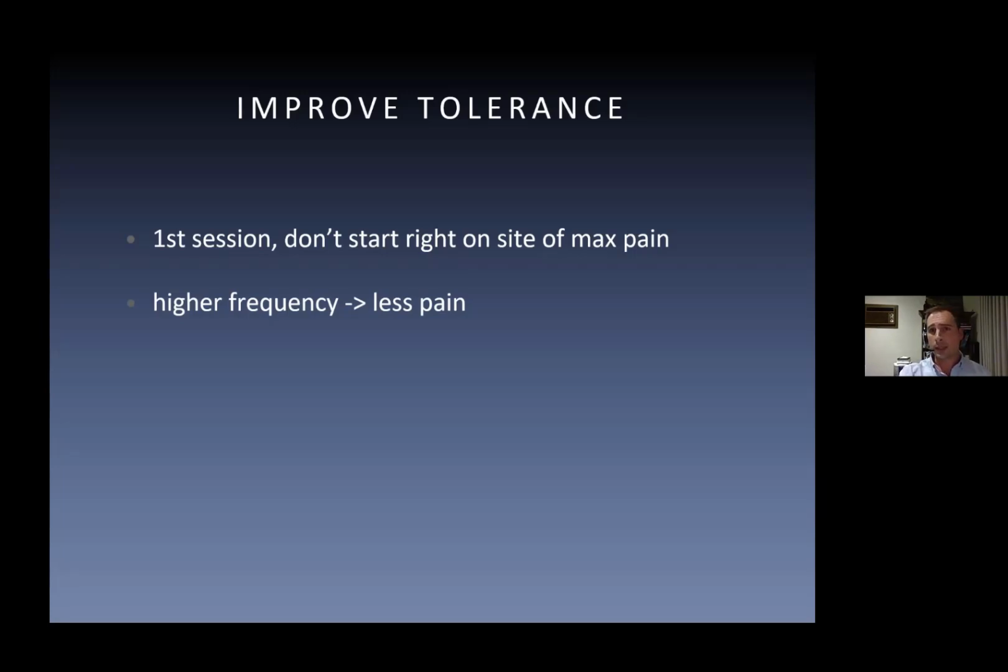When I'm dealing with areas close to, for example, the insertion of the Achilles tendon, I tend to like using the larger applicator, the 36 mil one, because it can be quite a large tendon insertion. So I'm getting better coverage of that, and I also don't need as much penetration.